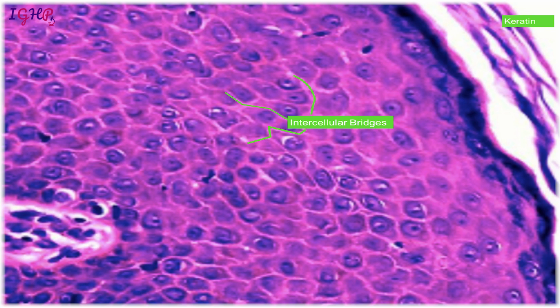So they are coherent and they are cohesive, and that is what we are looking for when we are seeing the cases of carcinoma. The other thing that we see in squamous epithelium is the keratin on the surface, like you see here. This is again an important feature, and if we see keratinization, then we call it a squamous cell carcinoma. So this is the importance of knowing the types of epithelium, so that you can identify them on the histology, and you can identify from which type of epithelium which tumor is arising.